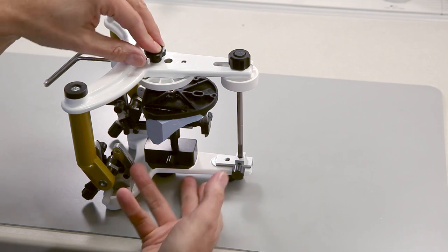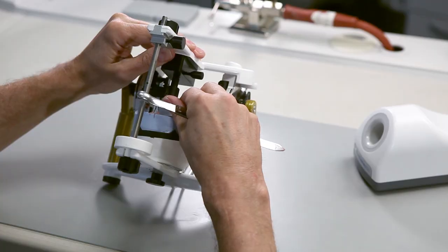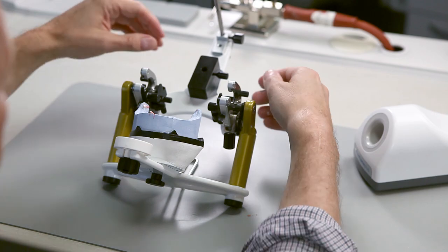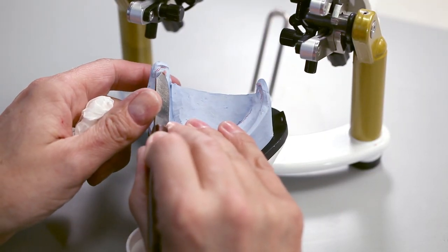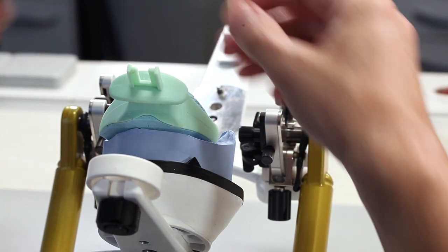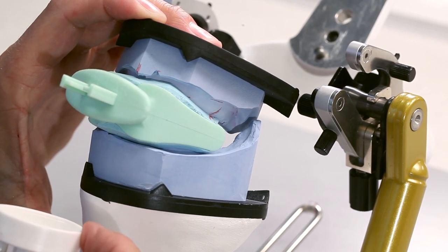Articulate the models in the usual way, with or without a split cast system. Once the plaster has set, you can carefully detach the horizontal guide from the mandibular model and remove the instrument carrier. Also, remove any interfering residues of sticky wax without damaging the model. Reposition the centric tray and check the fit together with the maxillary model. The markings simplify the aligning of the parts correctly.